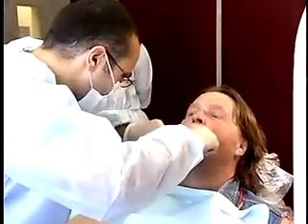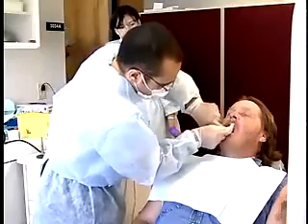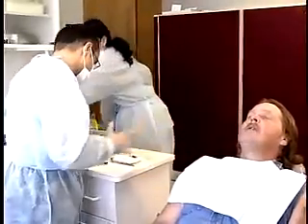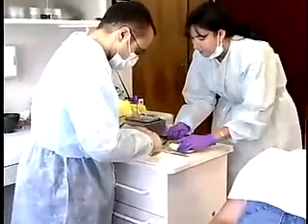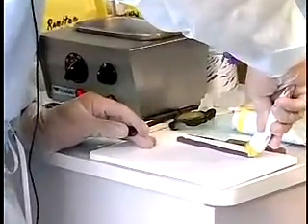Ask the patient to dry the palate and basal tissue with gauze. Have the patient close and retain the gauze in the mouth. Remember, over-drying the mouth will stimulate salivary flow. If using rubber base impression material, place equal 4-inch lengths of light body base and catalyst on the mixing pad.